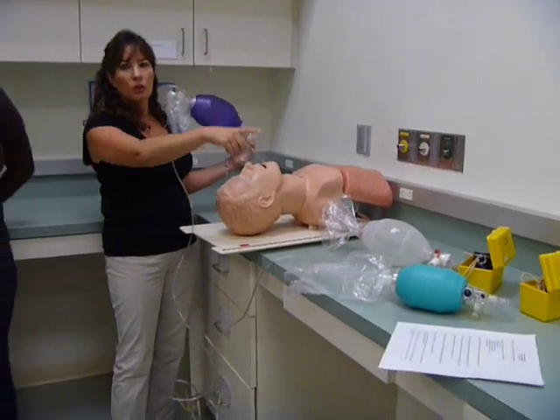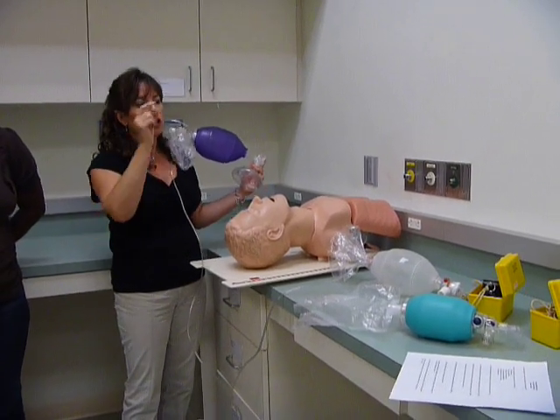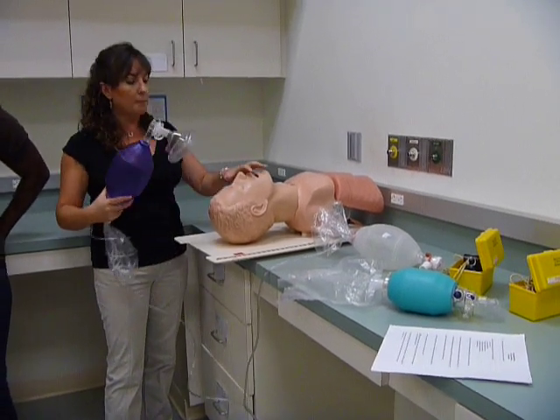At this station, you're going to measure volume with one squeeze and then two squeezes, see if the valve opens up when you take a spontaneous breath, and manually resuscitate your mannequin.